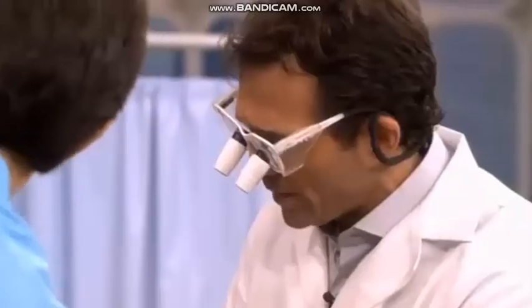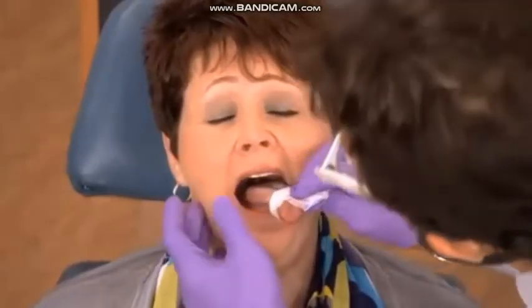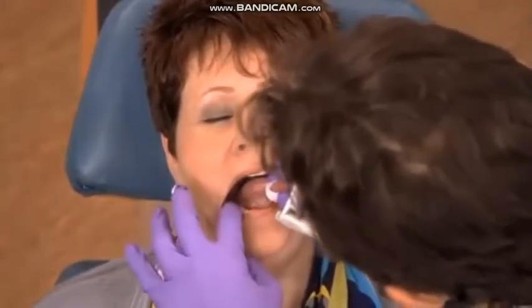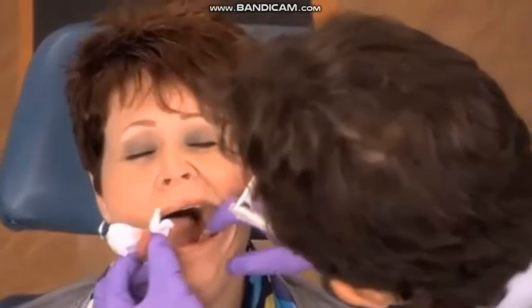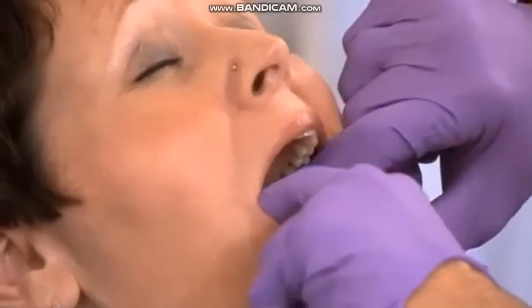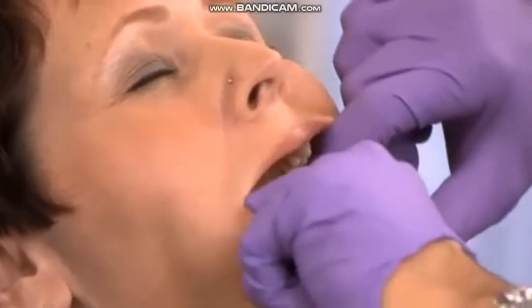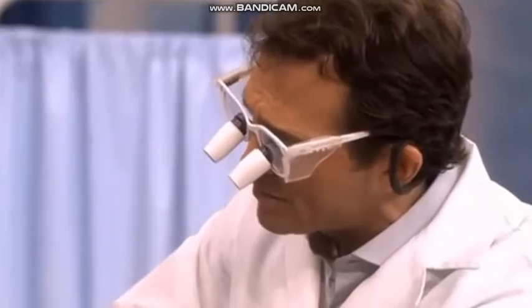And now stick out your tongue, and the traditional way we use this gauze is as a tongue lasso. We go right around the tongue, and we're able to see the sides of the tongue, underneath the tongue, towards the floor of the mouth, left, right, and we'll say ah, and we're looking for any unusual red or white spots, any dark spots in the mouth.